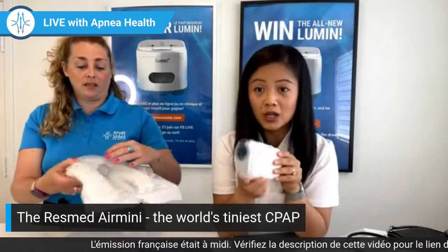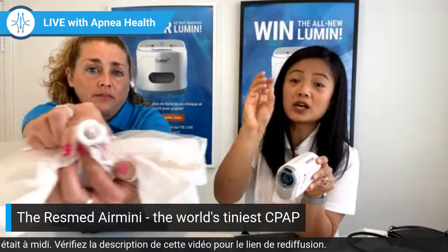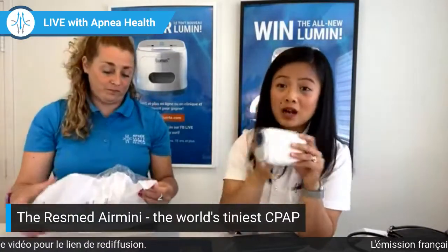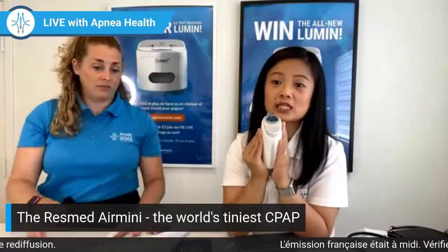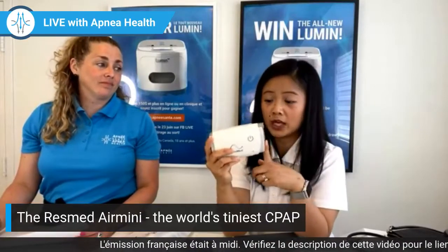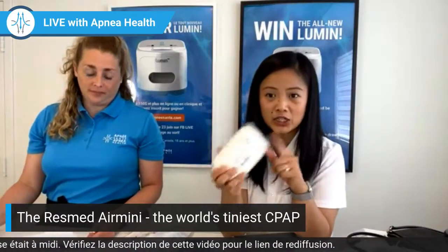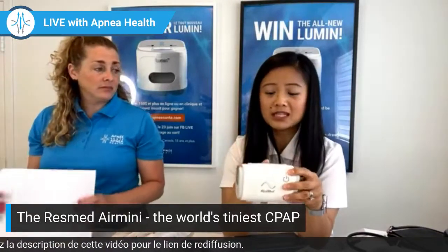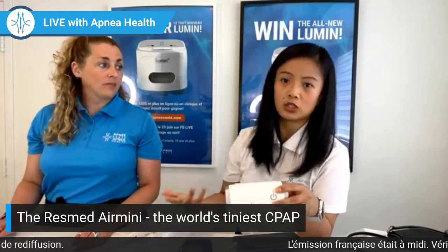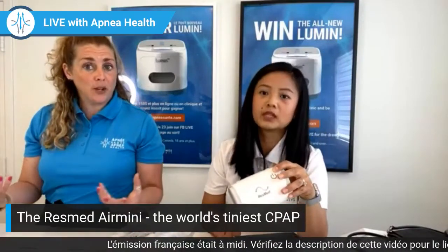In other words, you cannot use any other tubing. And also because of that HME filter, it needs a specific casing for it. Because of that, there are only a small number of masks compatible with the Airmini. That would be the limitation, the biggest limitation of the Airmini. The Airmini is actually the only CPAP that is not universal in terms of compatibility with masks, because every other CPAP is compatible with every other mask.